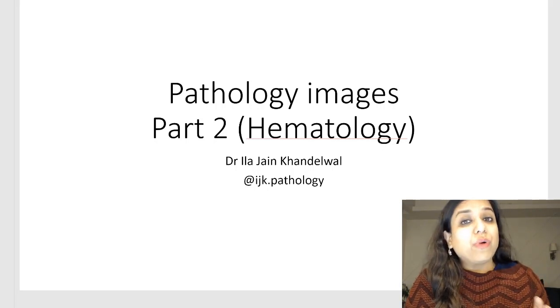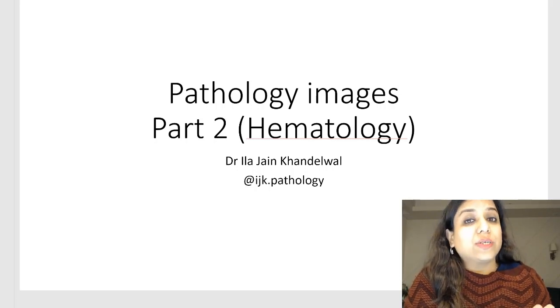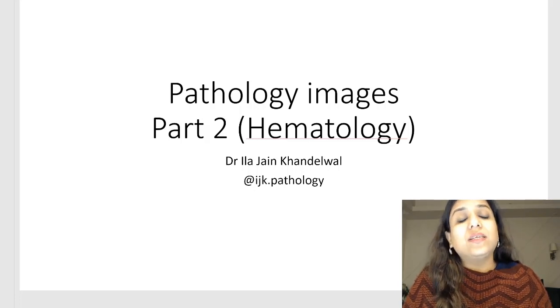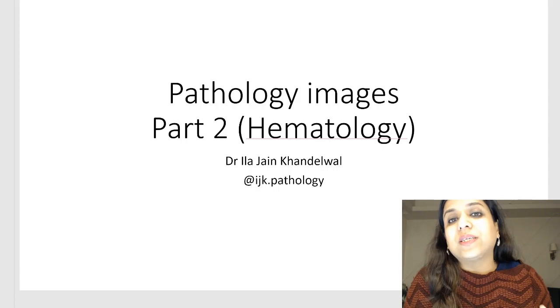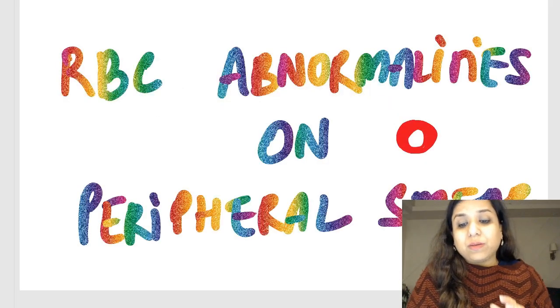I promise you students that the images which we are going to do in this module are extremely important for all the MCQ exams, whether it is INI-CET, NEET or FMGE. So just before your MCQ exams, whenever you are revising images or pathology, please go through this module or all these images. So let us start with the first with the images students.